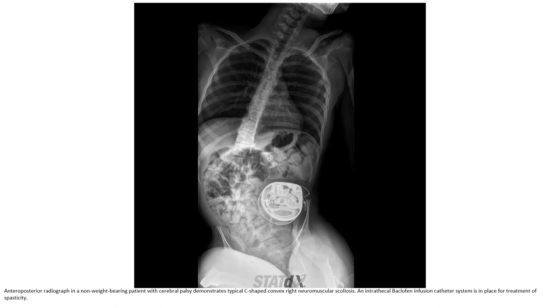Also very often present. This is an AP radiograph in a non-ambulatory patient with cerebral palsy demonstrating what is called a C-shape convex right neuromuscular scoliosis. An intrathecal baclofen infusion catheter system is in place for treatment of spasticity.